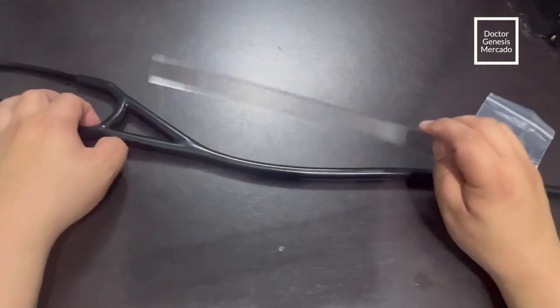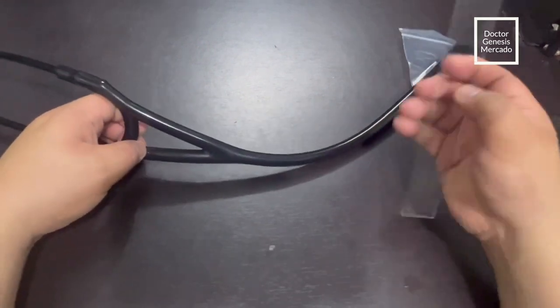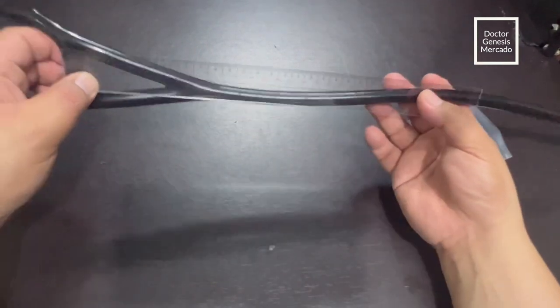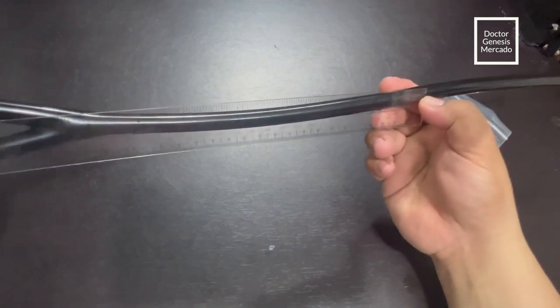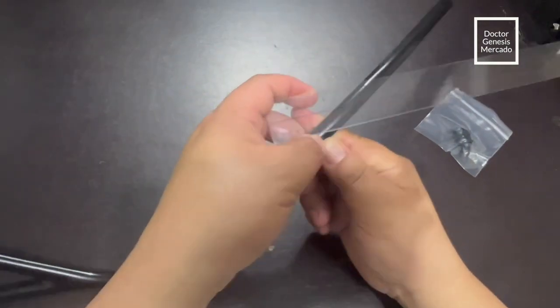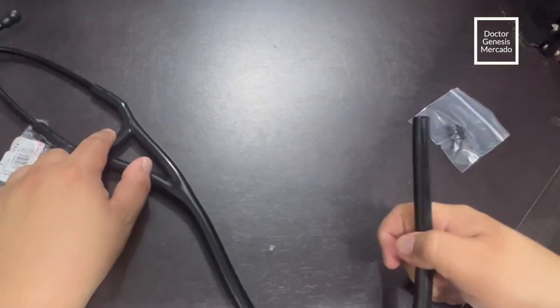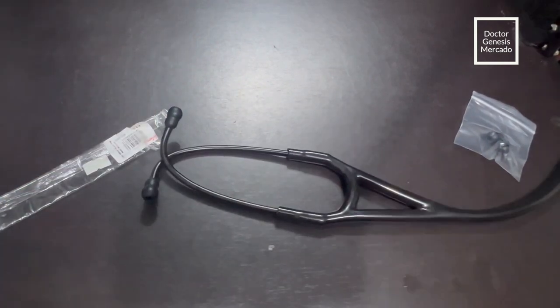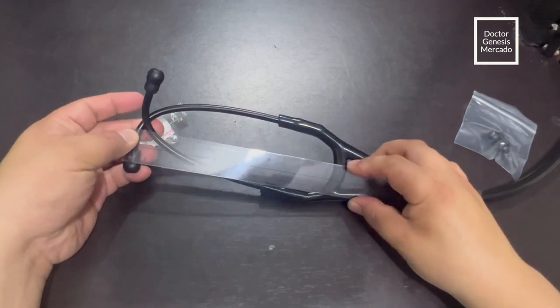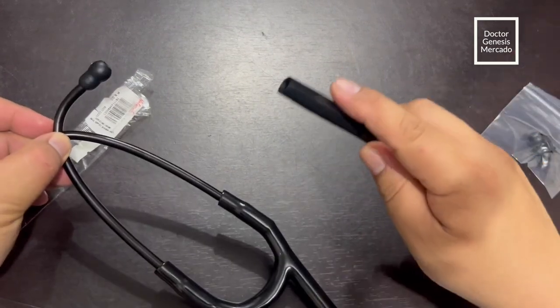So we will measure it from here up to the end of the tube. So this is 12 inches up to this one, plus 7.5. So 19.5 from here up to the end. Okay? So 19.5, if you want to measure from the tips up to here, 19.5 plus 7. So 26.5 from here up to the tip.